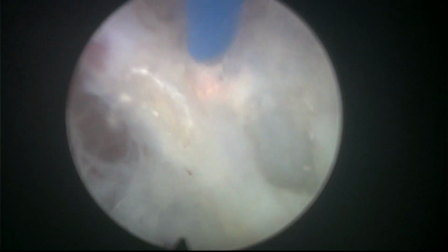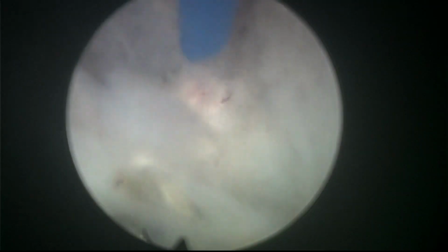often when the angle of dissection is changing. For example, here we are on top of the adenoma. I start pointing down a little bit with the fiber, because the angle is that way. And when I am below the adenoma, I have to be careful that I don't go through the retrotrigonal area. So what I do is I keep the targeting very close to the adenoma.